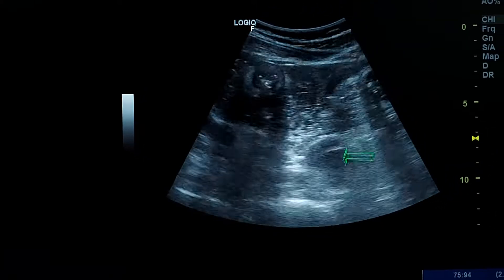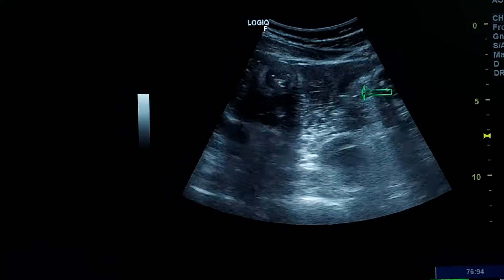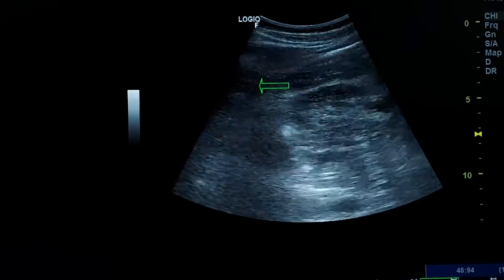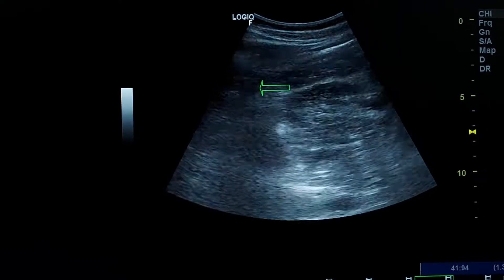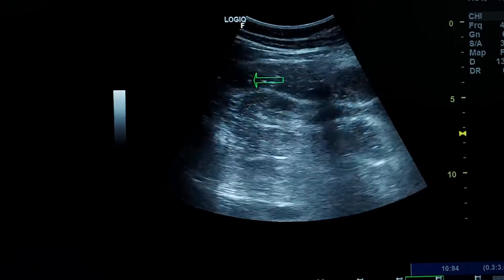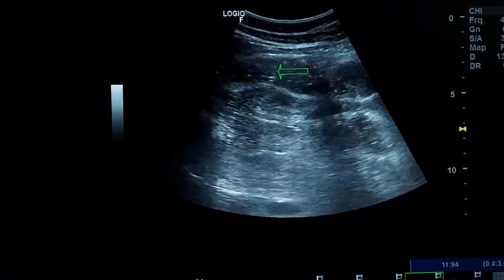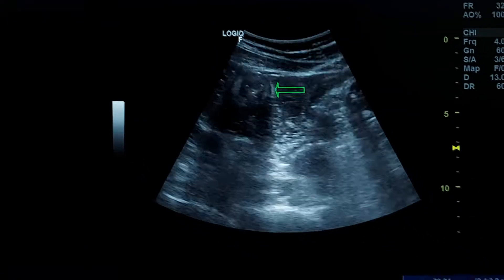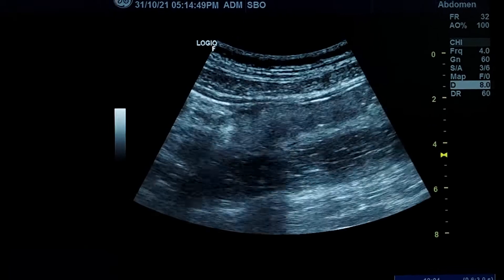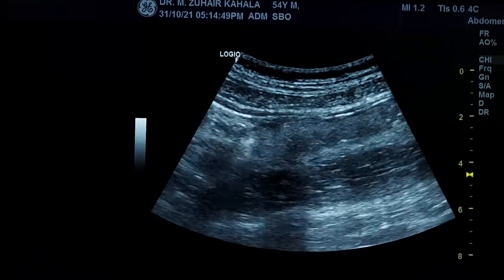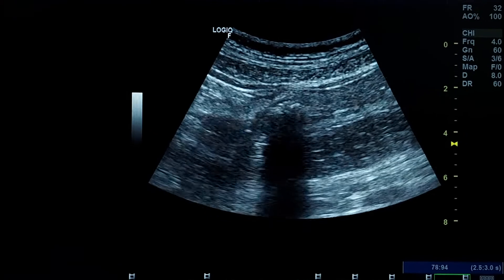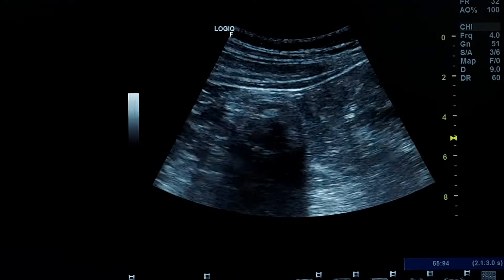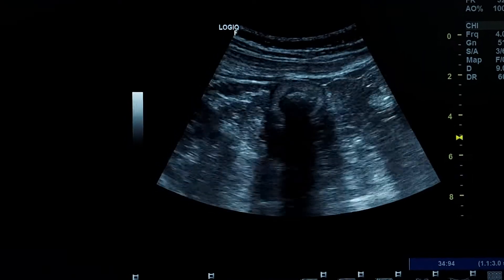These are the small bowel loops — ileal small bowel loops. This is the terminal ileum, which was confirmed to be the terminal ileum by CT. This is the same small bowel loop which is the terminal ileum.